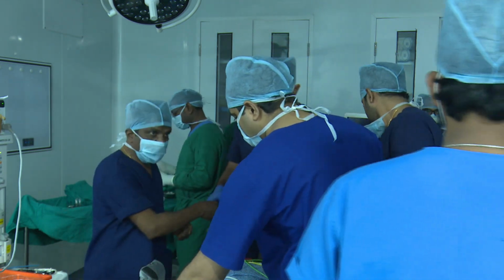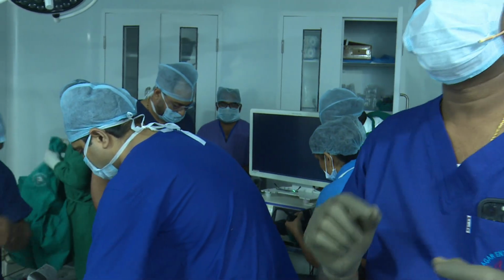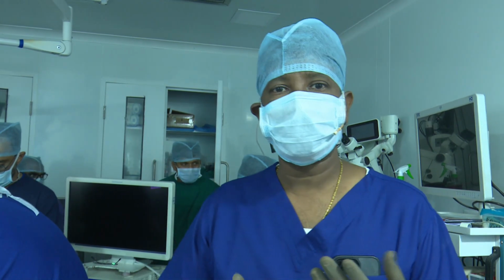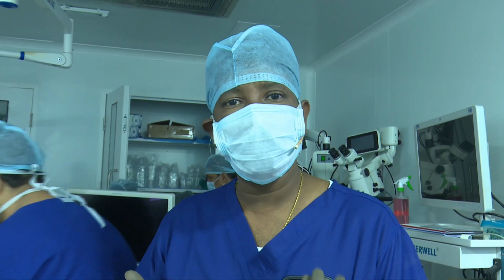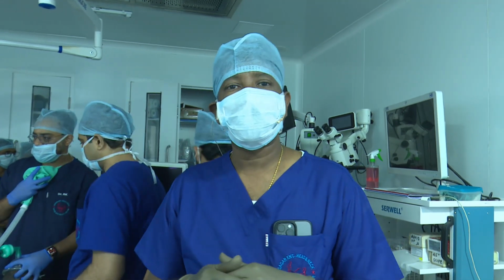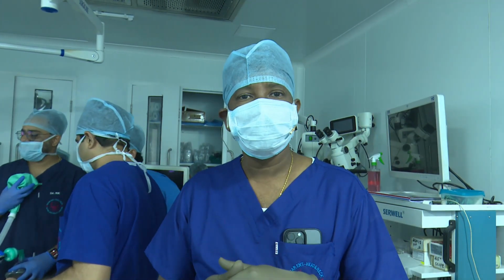In this case, the flow is mainly palatal. Yes. So we used to assess the oropharynx by keeping the scope at the level of the lower part of the velum and looking for the larynx. If the epiglottis is partially blocking, we can say it is incomplete collapse of the tongue base. If the epiglottis along with the tongue base is completely obscuring the view of the vocal cords and larynx, we say it is complete collapse at the level of the tongue base. In those situations, we do the Muller maneuver and assess whether any mandibular advancement device or external framework surgery will help or not. And also we can assess whether tongue base surgery will help.